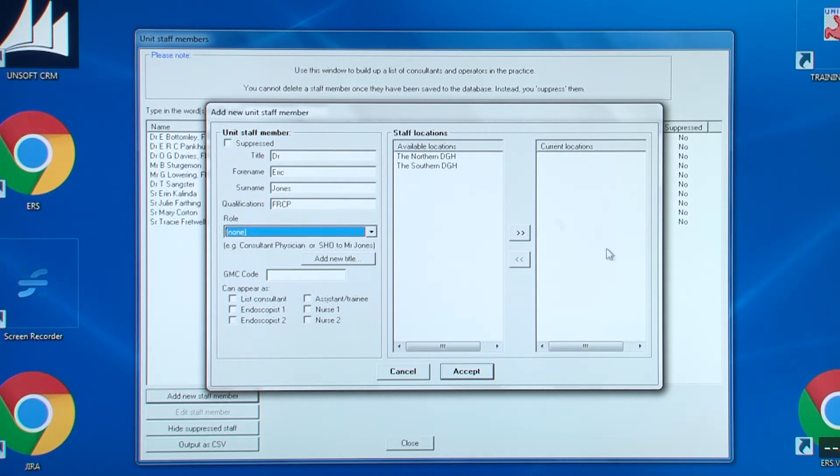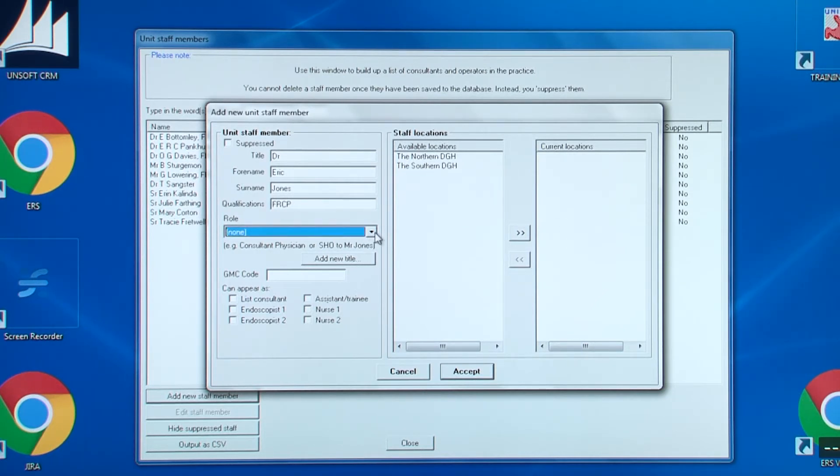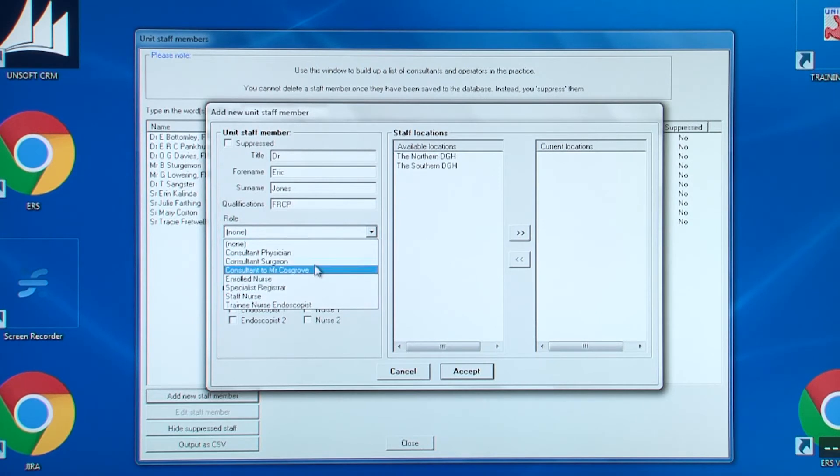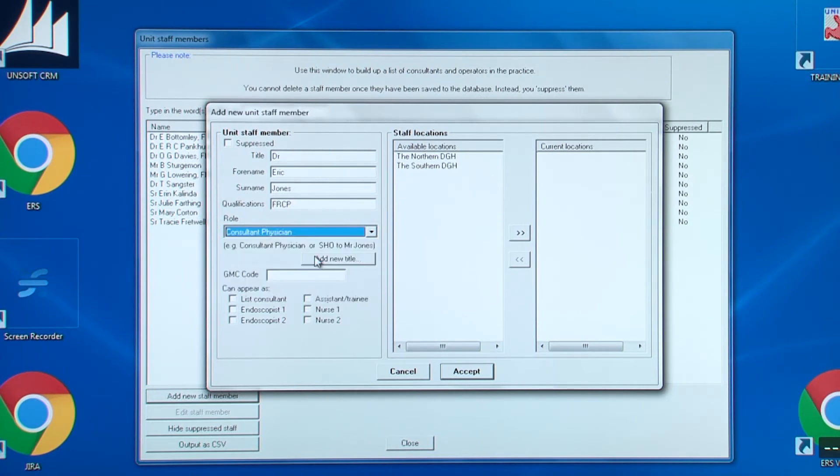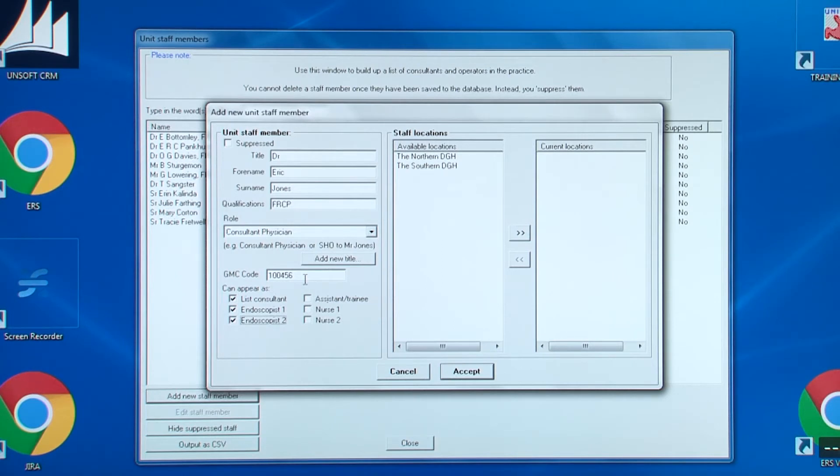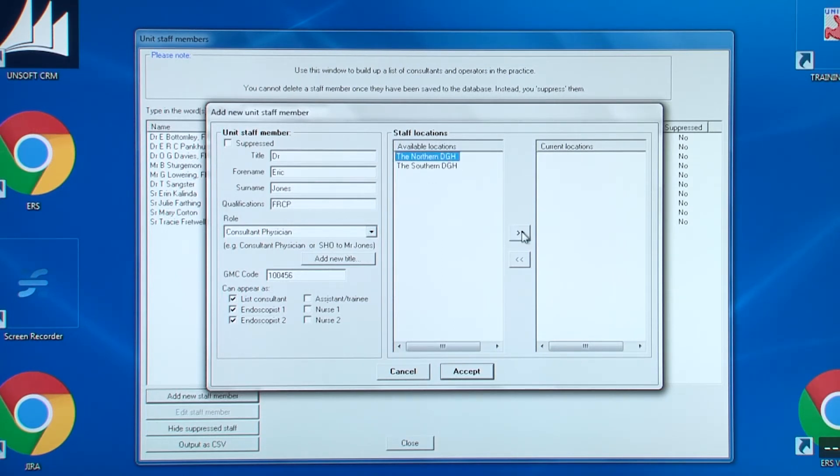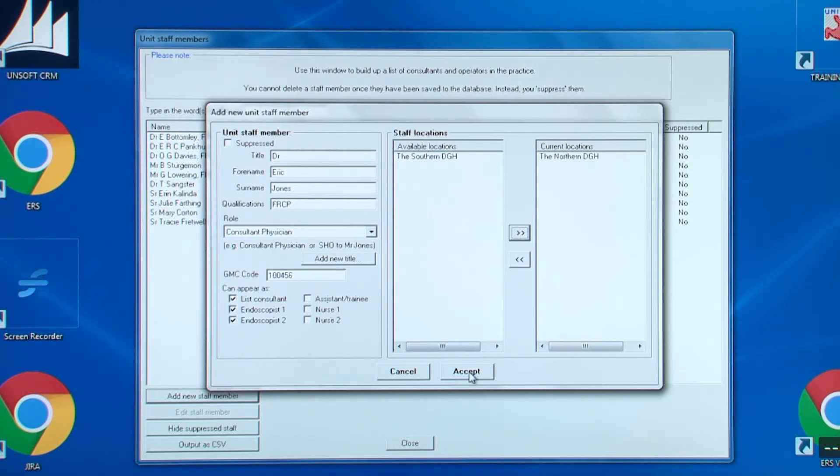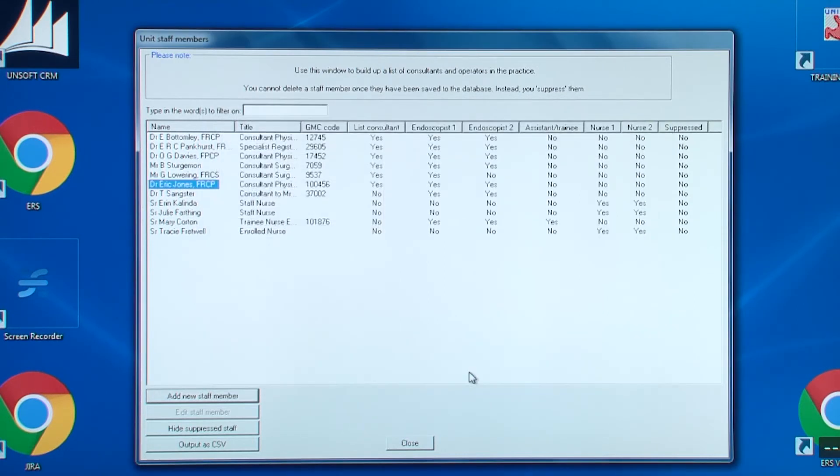If the person's role does not appear in the drop-down box, then click add new title. Then select whether they are endoscopists or nurses. In this example, because the database covers more than one hospital, you need to select the appropriate location for the staff member. Then click accept. The new staff member is added. So now, let's look at editing a staff member.